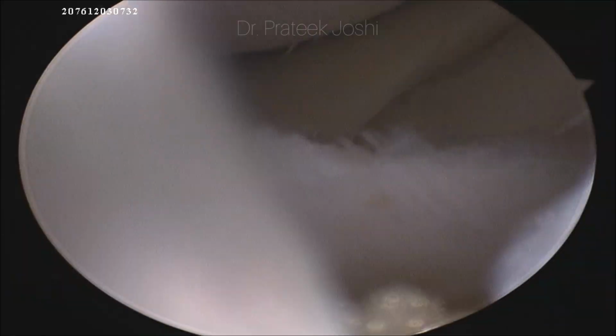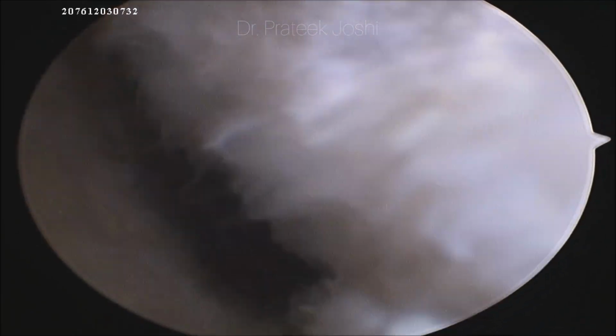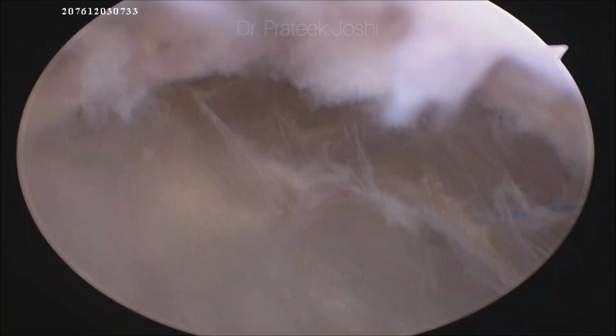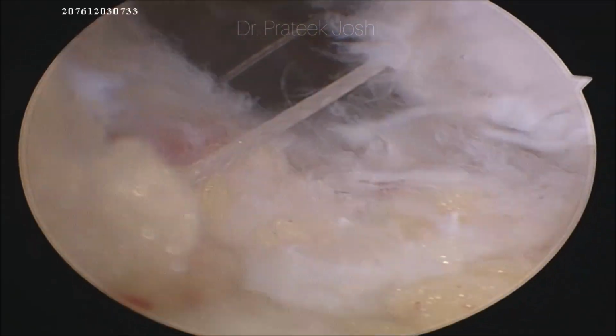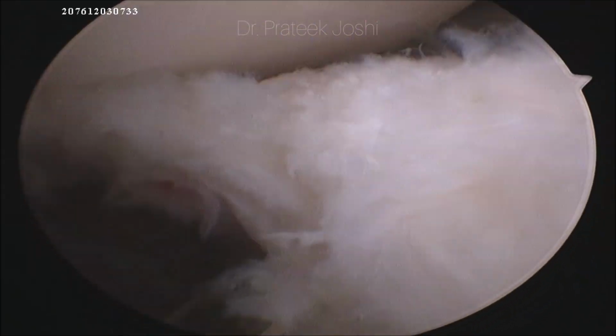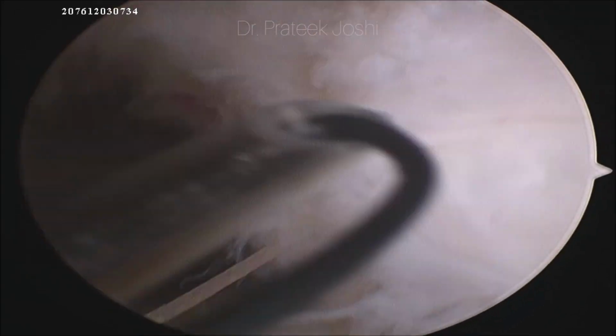So till now we have taken two outside in suture and one inside out suture. Now I am going to visualize this suture through the defect. There you can see the blue thread is the inside out suture, followed by the outside in suture number 2, followed by the outside in suture number 1.